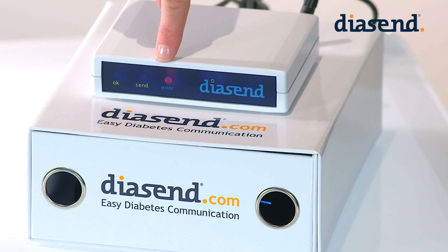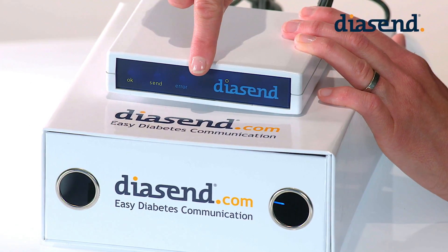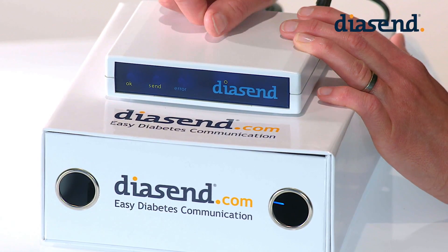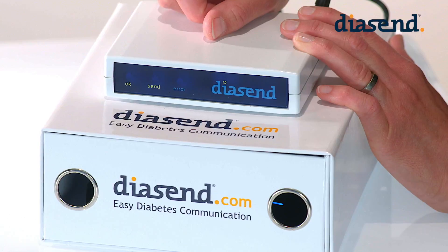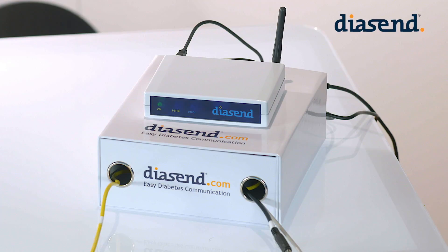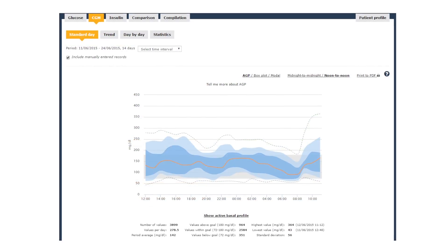The red error indicator shows a steady red light to indicate that a device has not uploaded to diasend. The diasend transmitter also has an infrared eye, and although you cannot see it, the infrared eye is hiding behind the panel. The infrared eye is used for uploading devices that have this technology, such as many of the Roche devices and Animas pumps. The green indicator also comes on as a solid light, not flashing, to signal that a device has been successfully uploaded to diasend.